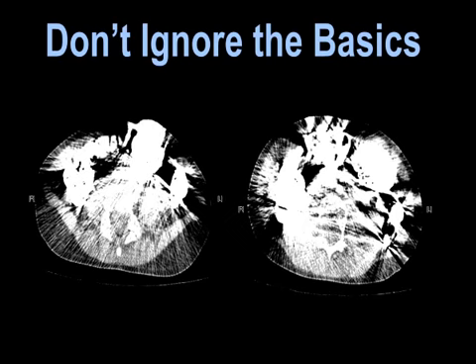And this came in as an outside study, okay? This was somebody who had barium. Barium and CT are not like peanut butter and chocolate, okay? They don't mix very well. And it's had a barium study, got a CT examination to evaluate abdominal pain. This should have been picked up on the SCOUT, the topogram. It should never have been done, but it was done.